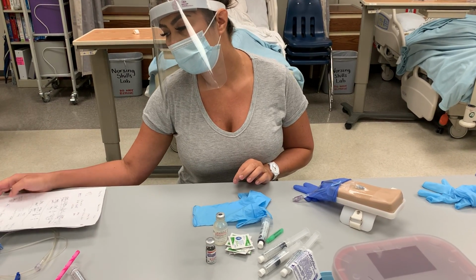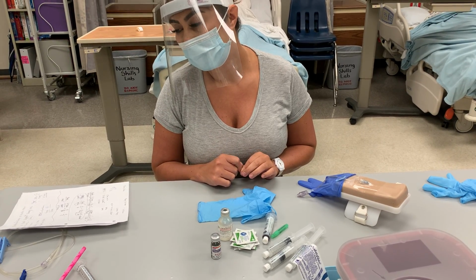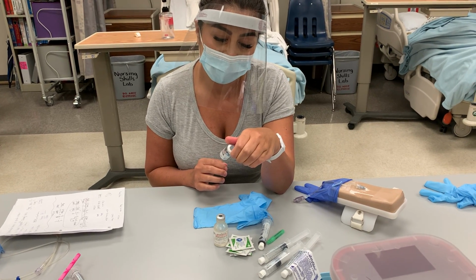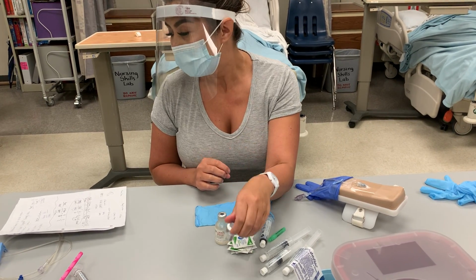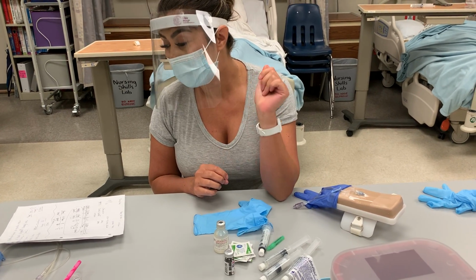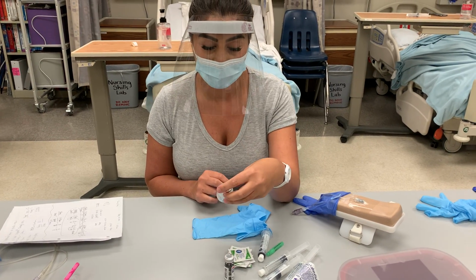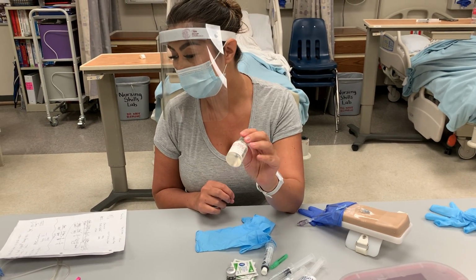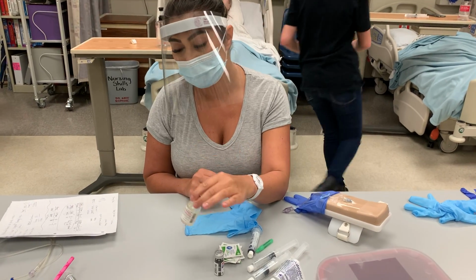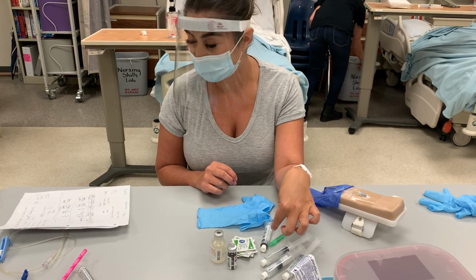I have an order for morphine, 4 milligrams IV push now, and on hand I have morphine 5 milligrams per milliliter. So the total amount that I'm going to be giving is 0.8 mLs of morphine. And then I'm going to be diluting it with normal saline, and I'm using 5.2 mLs of this so that I can get to a total of 6 mLs. And that's what I'm going to be drawing up inside my syringe.